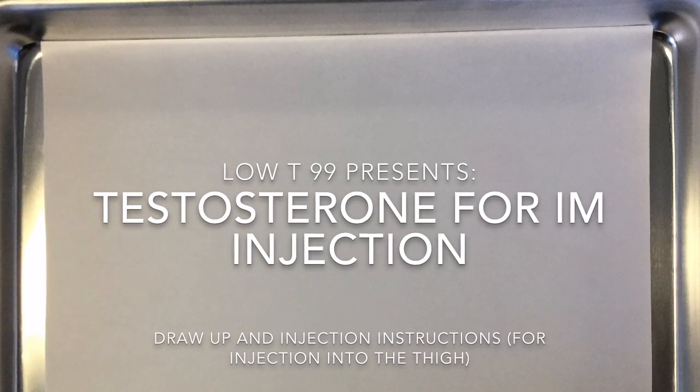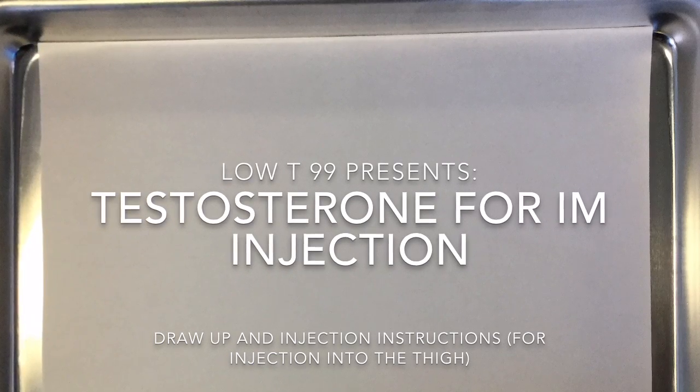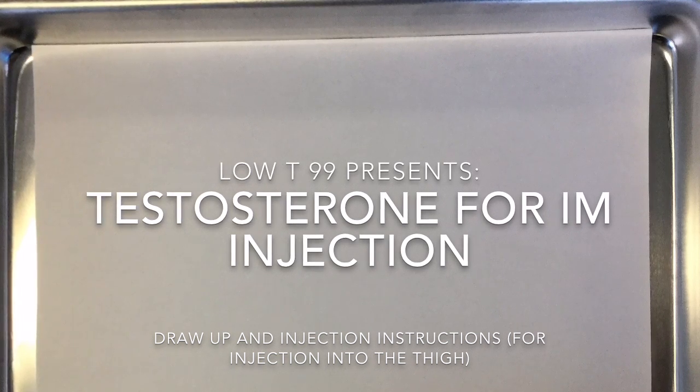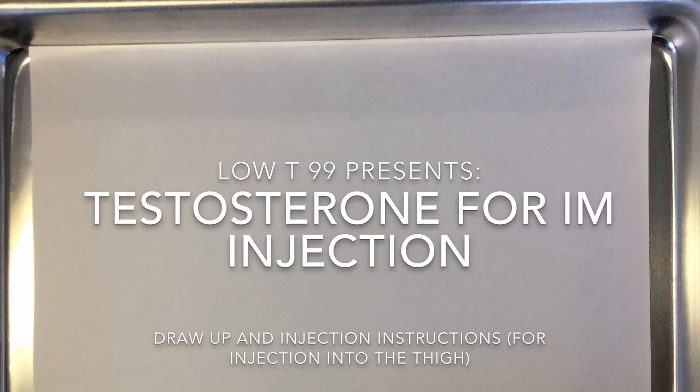Low T99 presents Testosterone for Intramuscular Injection: draw up and injection instructions for injection into the thigh.